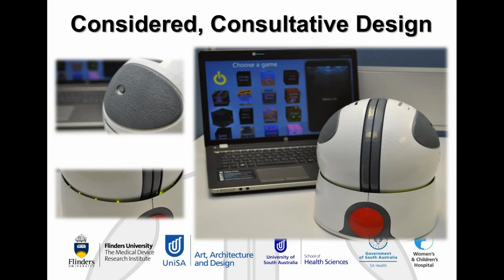When you plug the system in, it also shows you with visual feedback that it's turned on and ready to use with green LEDs which show up around the rim of the bottom here. So our final controller here, if you're into some advanced manufacturing, has also been 3D printed. So everything you can see on this controller except for the acrylic base, which has been laser cut on the bottom, is actually being 3D printed locally here in Adelaide, which also gives it a bit of texture, and you might be able to pick up on some of that texture around the oval pad with the photo here as well.